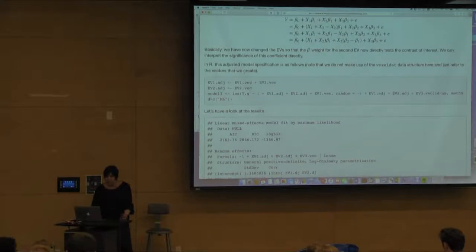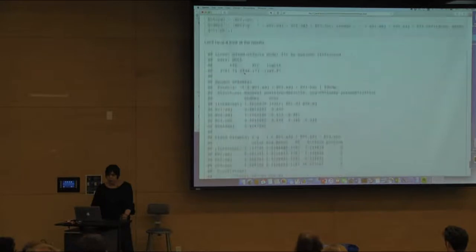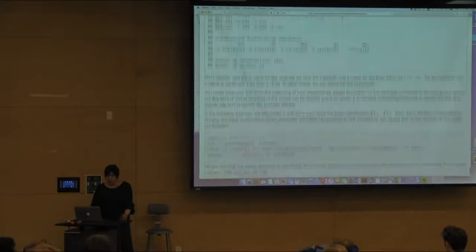This is confusing even to explain, right? So the last thing that you want to do is you don't want to have to mathematically readjust your explanatory variables to compute the contrasts of interest every time you want to do that. And we don't do that. So what we do in fMRI analysis is we specify the explanatory variables in the most solid, straightforward way that makes sense to do, and then we specify what our contrasts are separately so that it makes sense. So this is just for the record, you can do this, but don't.